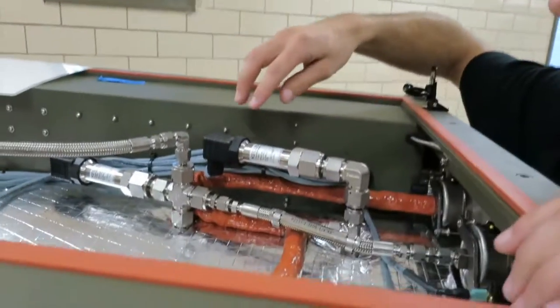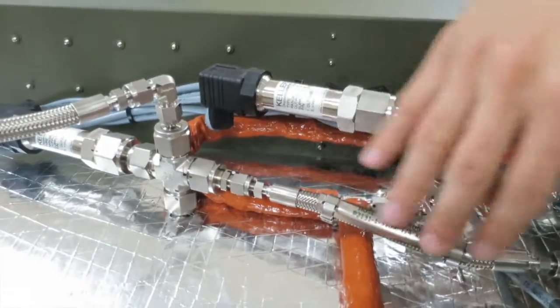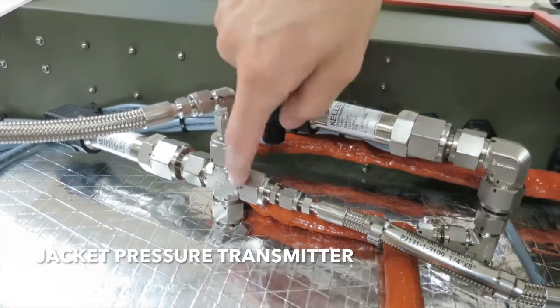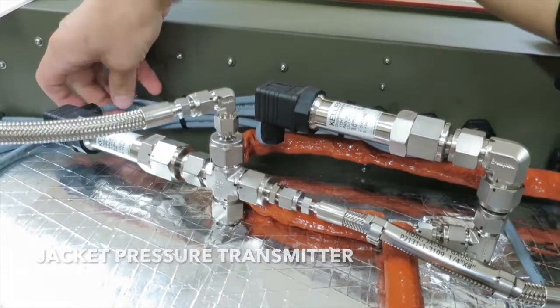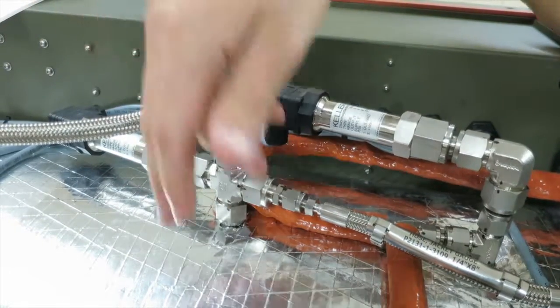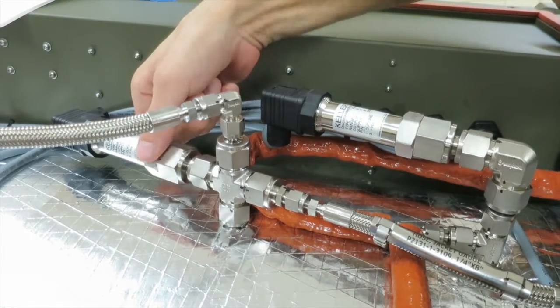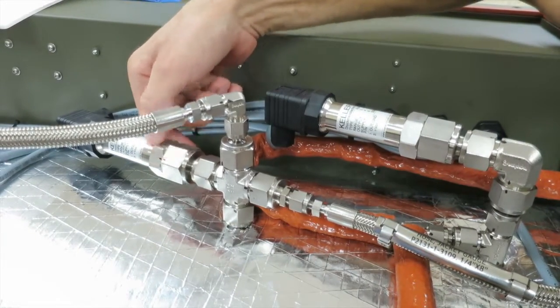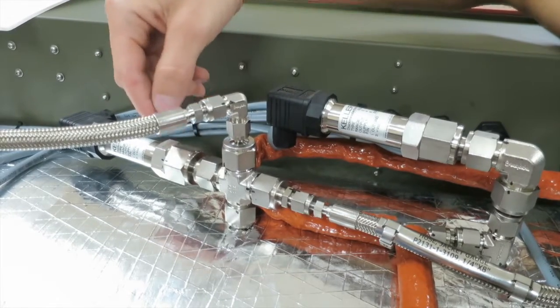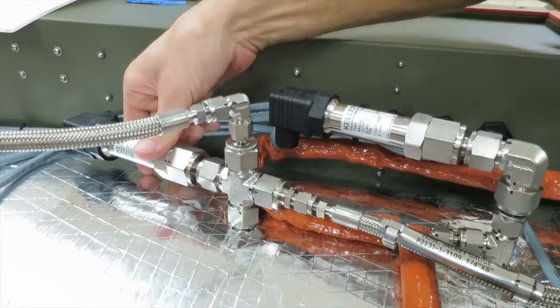Up here we have two pressure transmitters. This is the jacket pressure transmitter, and it reads the pressure in the jacket and sends the signal to the PLC so the PLC knows how much pressure is in the jacket. There's a little copper gasket that seals this fitting right here, and whenever you do maintenance on these, make sure that copper gasket is sealed and seated fully before you tighten down.